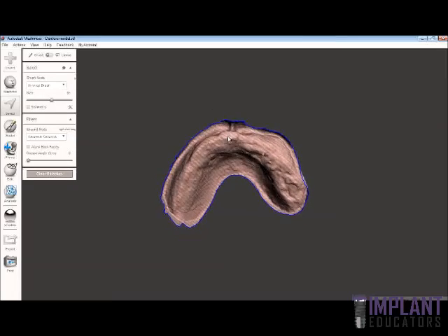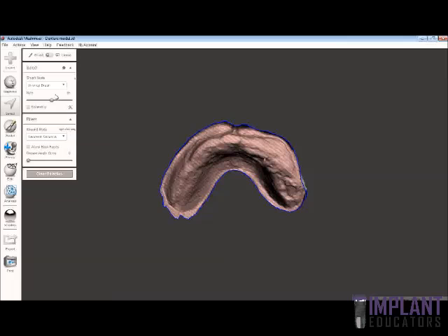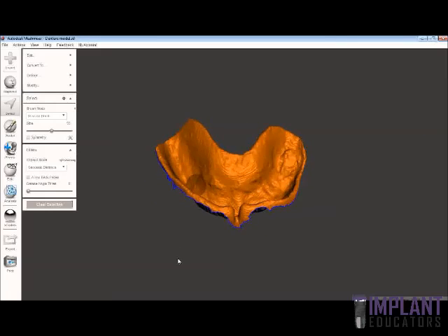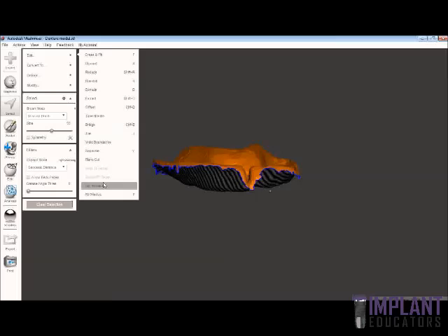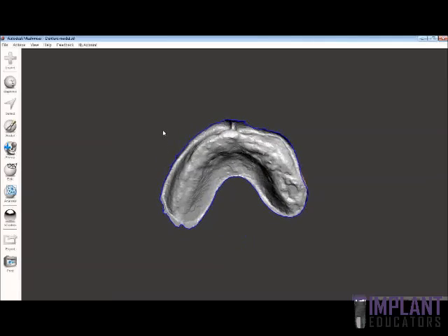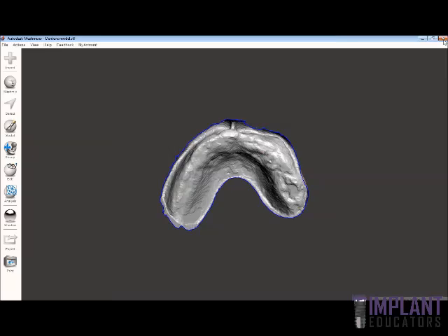We can now delete that outer shell, and what we see is an accurate representation of the soft tissue — basically the inside of the intaglio surface of the denture. This is still not reversed, so we'll need to select the opposite side, go to the Edit tool, and do a Flip Normals. Now that this is flipped, you can see there's a little area we can get rid of. It's not so important to get rid of it at this stage because you can use the isolate tool in Blue Sky Plan to remove that. We're going to export this and save it as 'denture model inverted.' We can then close MeshMixer — we don't have to save that, it's already saved.